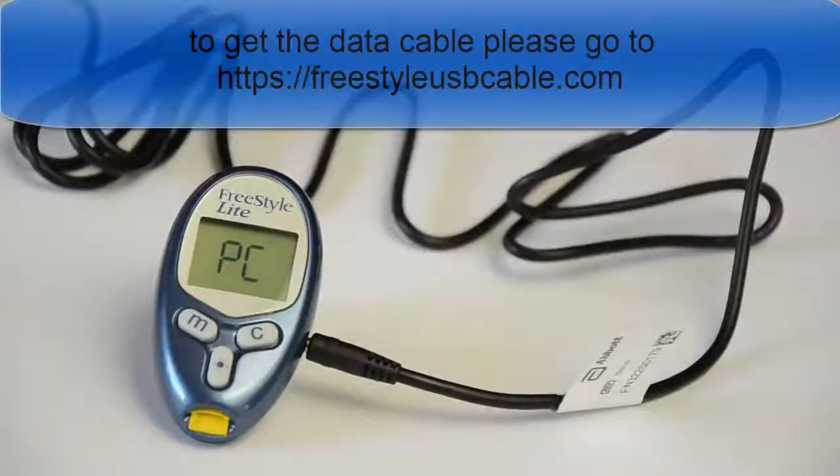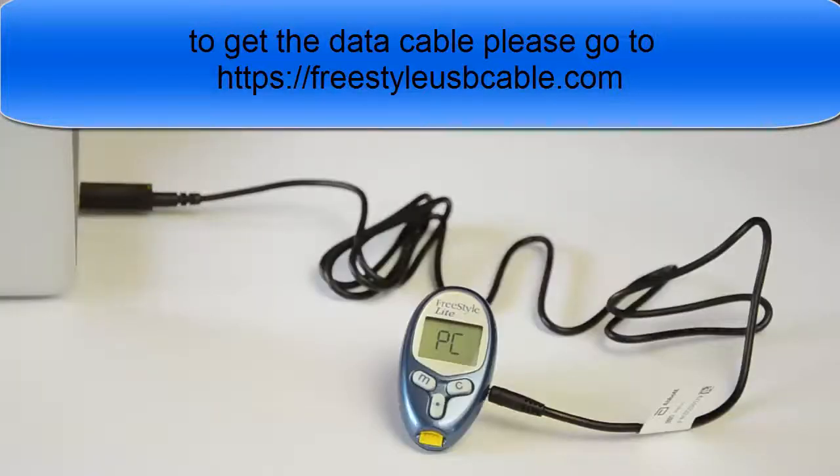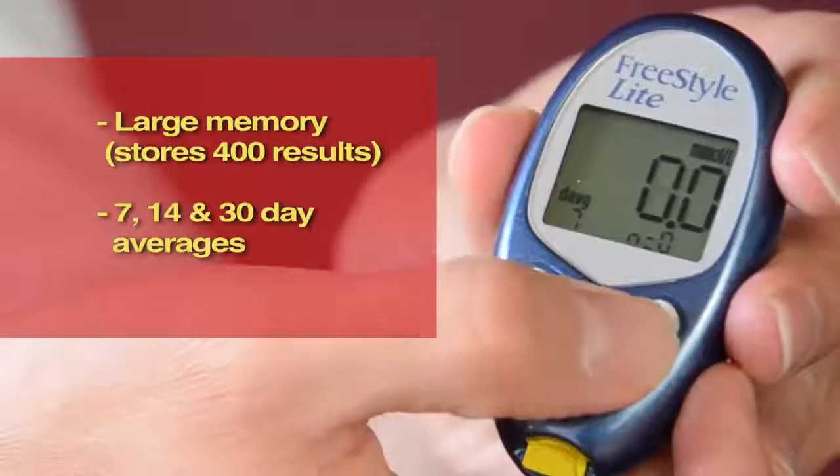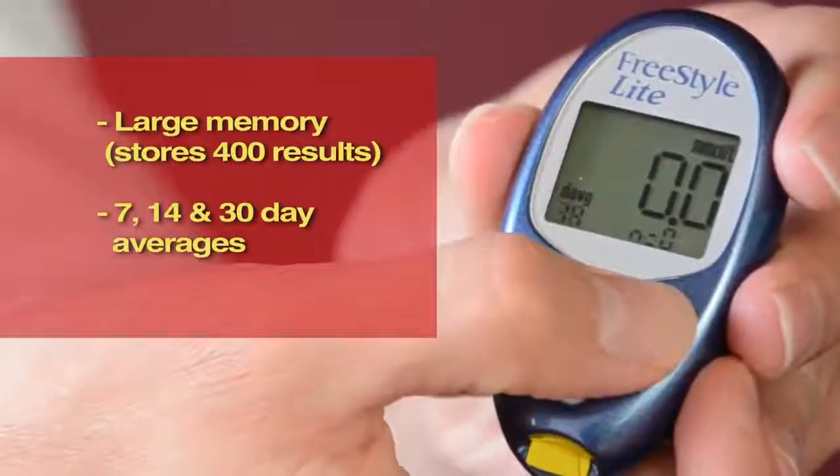The results can be transferred onto a computer. You will need to buy the data cable separately from the company and then download the free software. Note that the software is only PC compatible at this point in time. Features include a memory that records 400 results and 7, 14, and 30 day averages. It has a result time of 5 seconds, which makes it one of the quickest meters on the market. This is half the time taken for TrueTrack, and the meter would be ideal for someone who wants quick results.